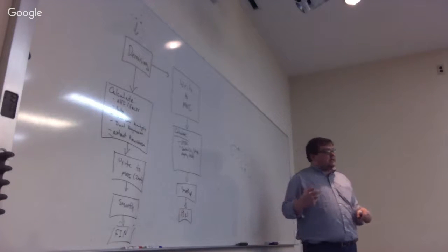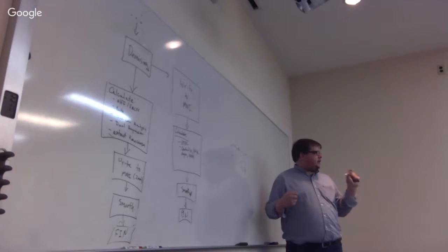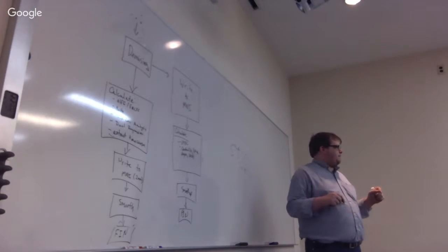For that reason as well, if you're used to using 6 millimeter smoothness and then you look at our data, it may look like it's a little bit less smooth, right? Because what you're doing when applying that 6 millimeter may result in 8 millimeter, for example, right? So that's just a caveat, you may notice that effect.